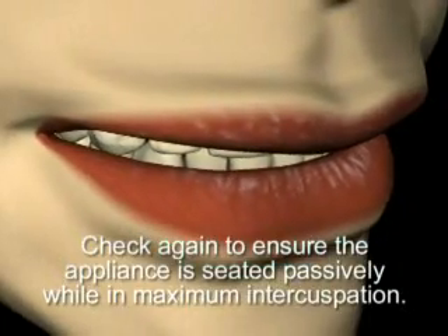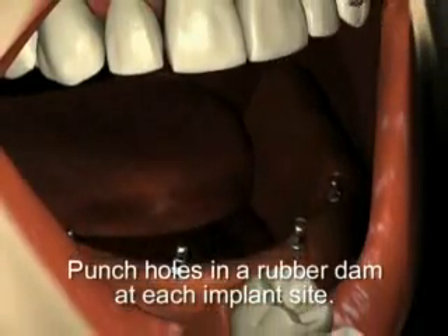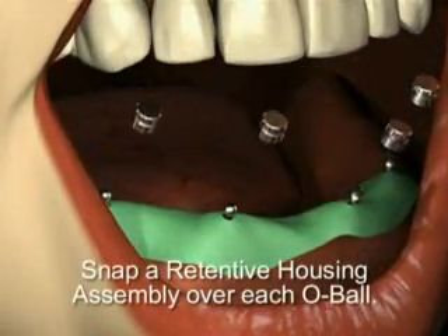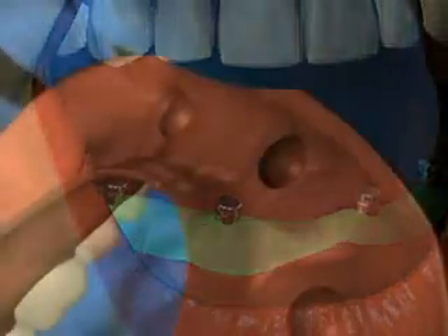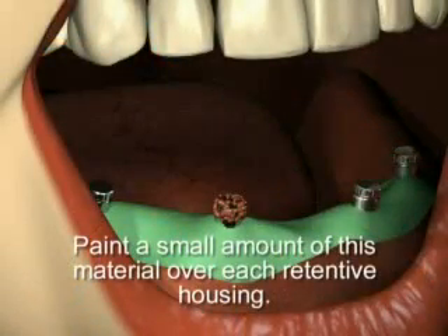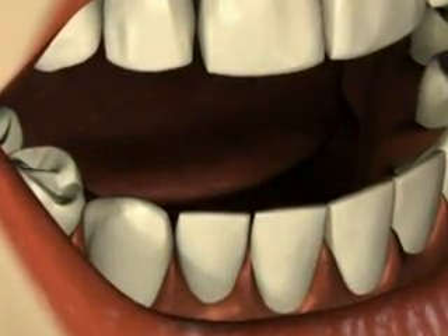Check again to ensure the appliance is seated passively while in maximum intercuspation. Remove the retentive housings to prevent any acrylic lock-on. Punch holes in a rubber dam at each implant site and place the dam over each abutment, leaving only the o-ball heads exposed. Snap a retentive housing assembly over each o-ball in preparation for final seating. Clean, wash, and dry the denture; fill the abutment recesses with self-cure resin and paint a small amount over each retentive housing. As soon as the acrylic becomes resistant to flow, seat the denture keeping light bilateral pressure on the occlusal surface.